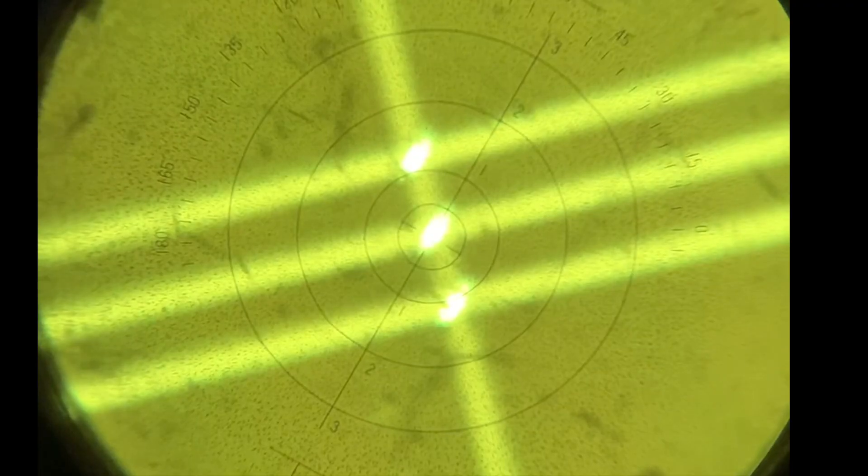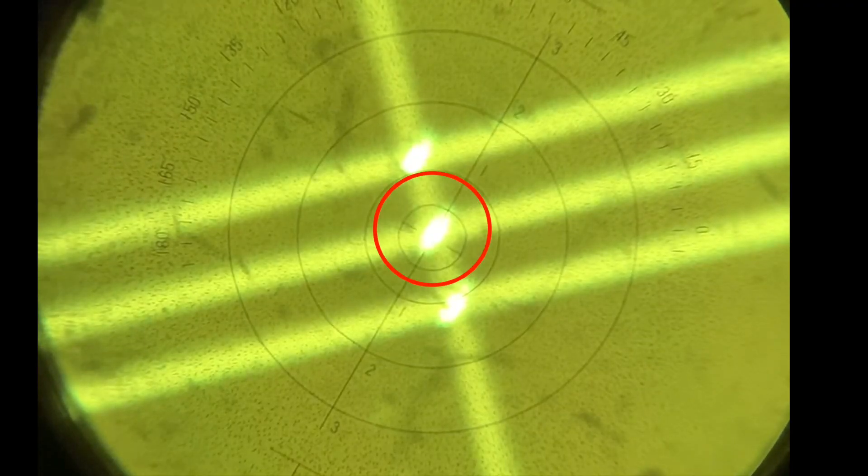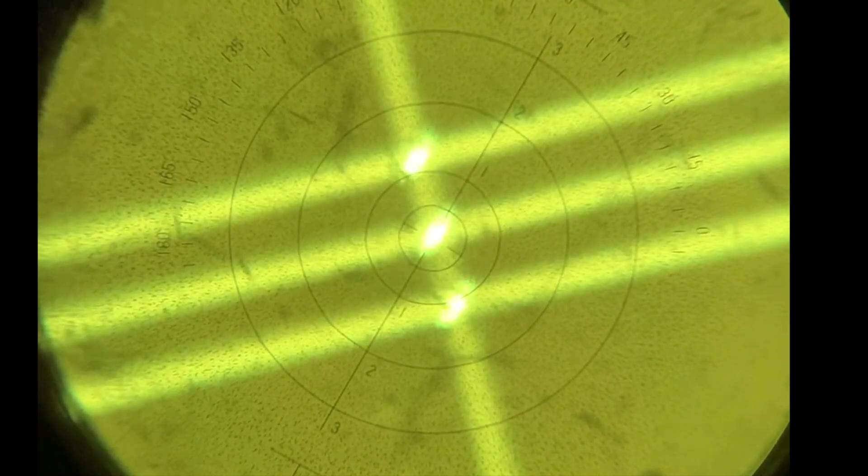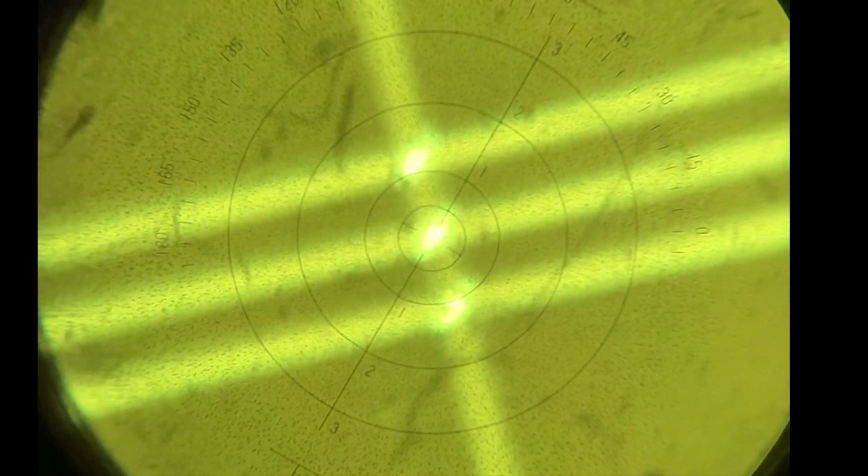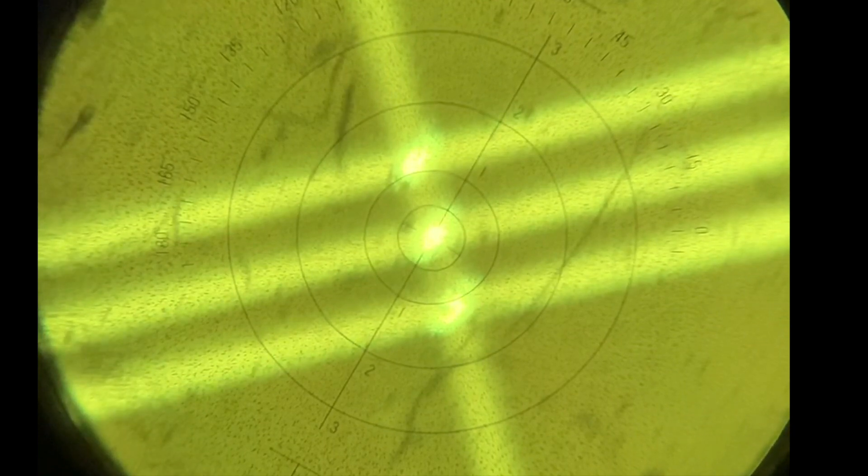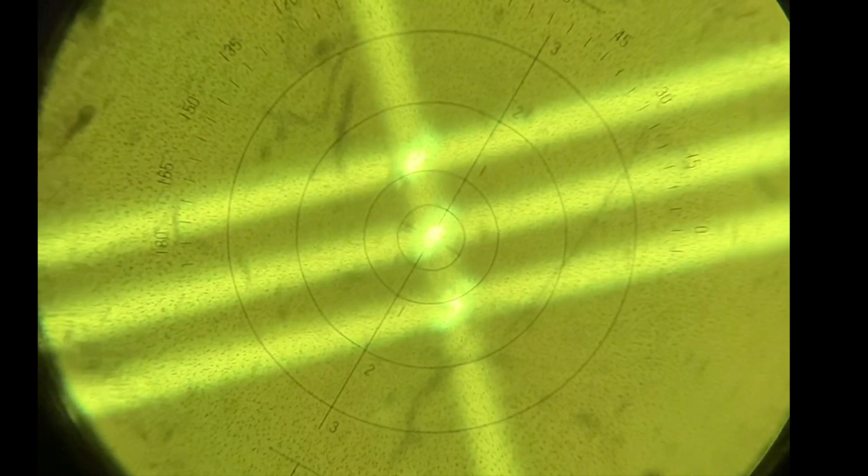Next, we'll look at a sphero cylinder lens. Notice lines appear broken. We need to adjust our axis wheel to find the correct axis for our power meridians.